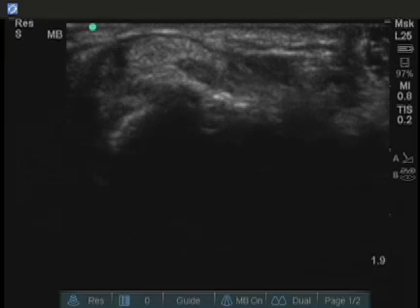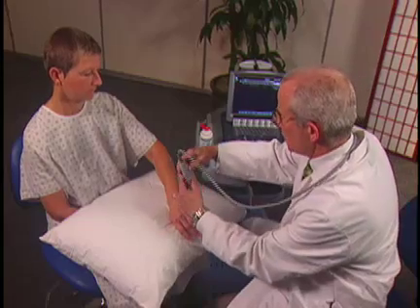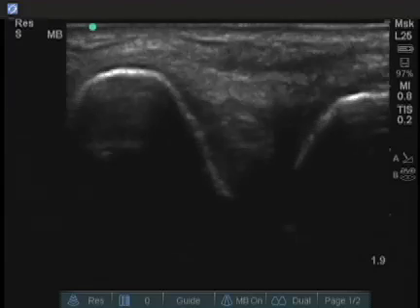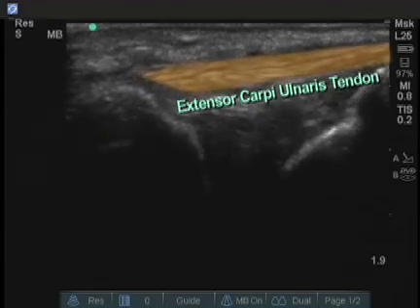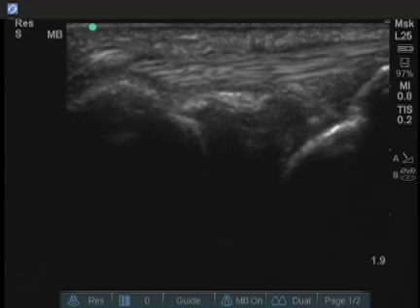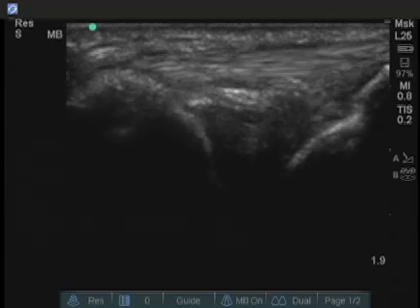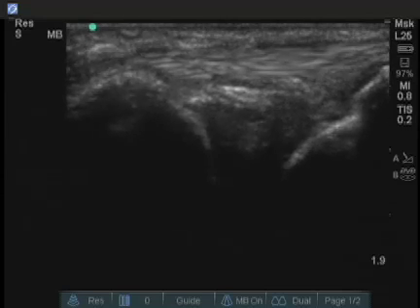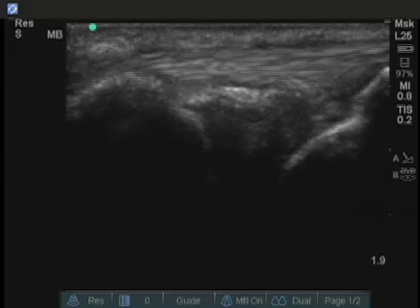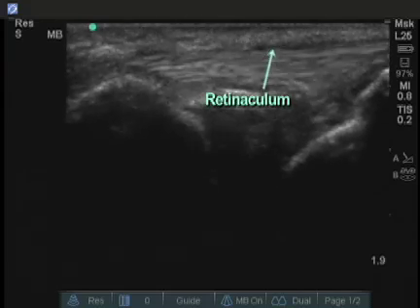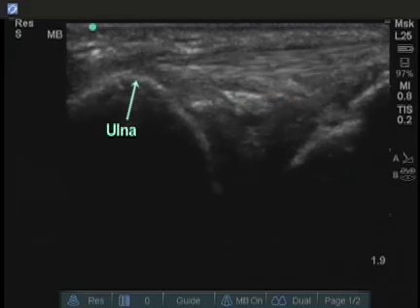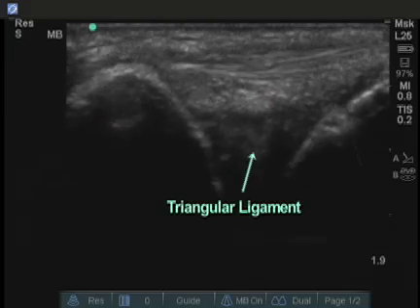The tendon itself is hyperechoic, and you can see the fibrillar nature within it. If we look longitudinally, keeping the dot proximal and finding the extensor carpi ulnaris tendon, you can see these parallel lines going from left to right — areas that are hyperechoic alternating with hypoechoic. This is a normal appearance of the tendon. You can also visualize the peritendinous tissue and the retinaculum up here. Deep to this is the distal part of the ulna, the first part of the carpal bones, and the triangular ligament is in here.